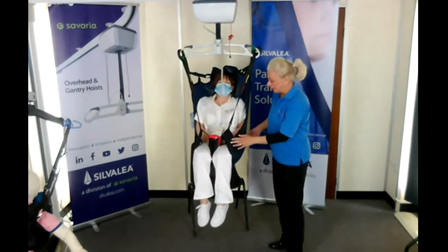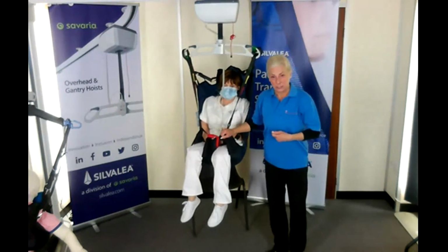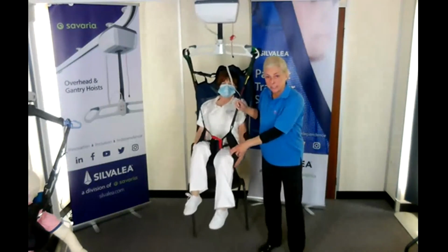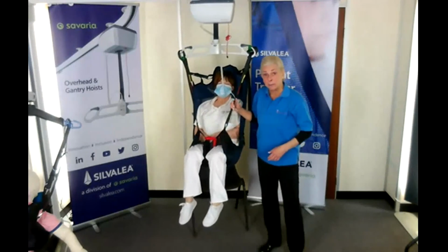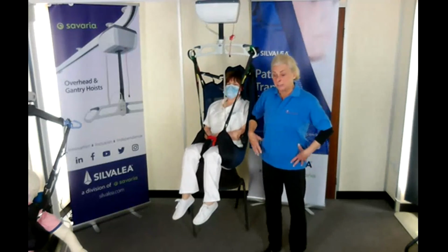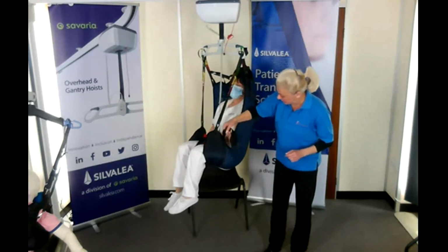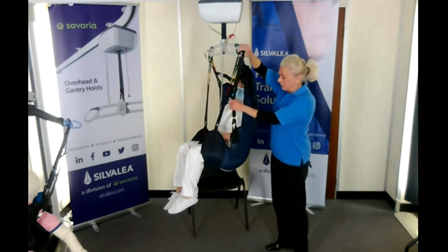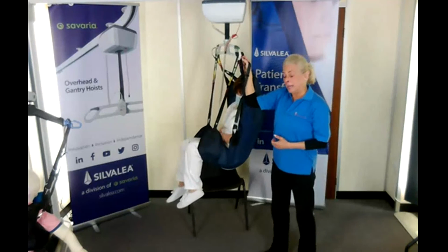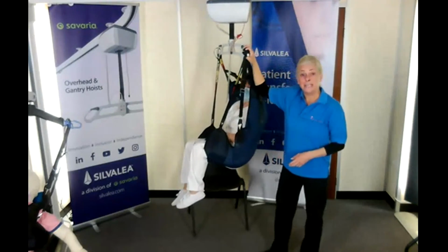But the deluxe leg, it wraps around each femur and gives more control than a standard general purpose shape. So if Jude was a bit wriggly, you've got individual control from those leg paddles. So quite a good shape. And if you've got differential because of windswept hips, then you've got more adjustment with a deluxe leg sling. But on this one, I've added hip tape. So hip tapes are additional, but they are really helpful if you're trying to lift the hip area here. So they just lift slightly and they will help with weight distribution.